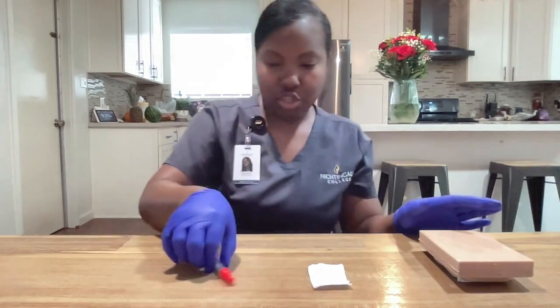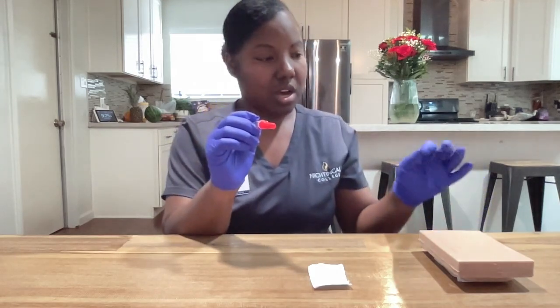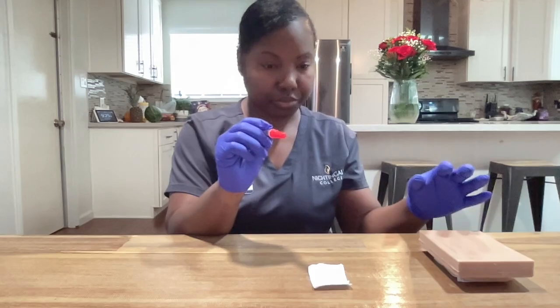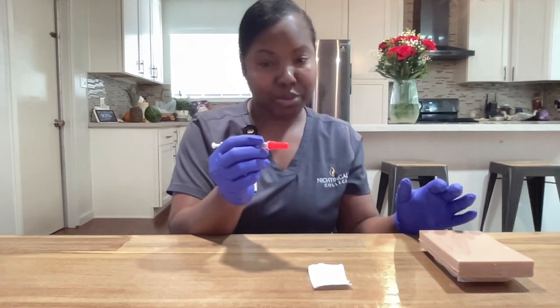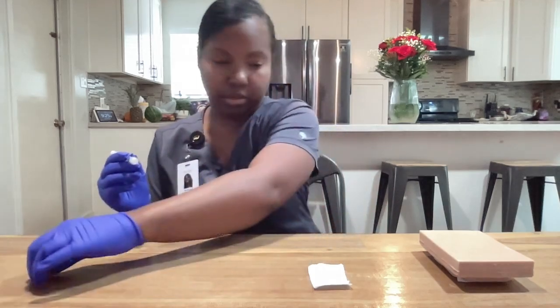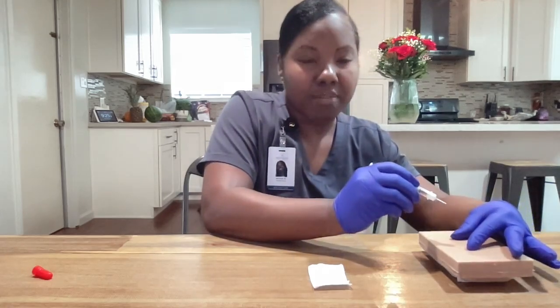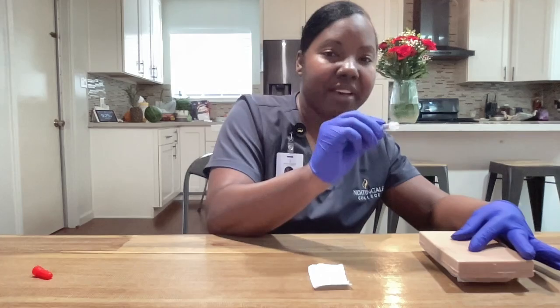Next, you will grab your needle with your dominant hand. With your non-dominant hand, you will apply traction to the patient's skin to stretch the area. Mr. Jones, I am about to proceed. I'm going to remove the cap from my needle. You want to inject at a five to fifteen degree angle, and you want to make sure that the bevel is up.